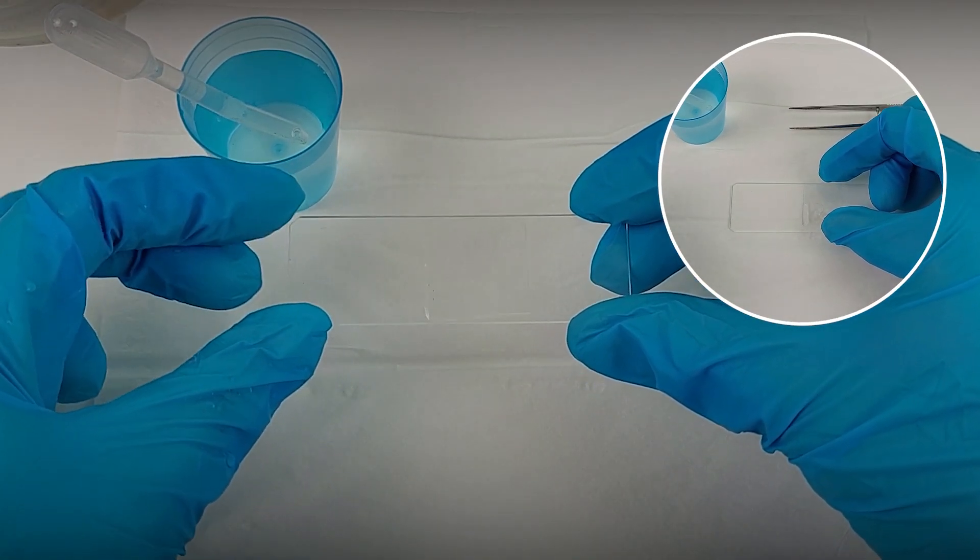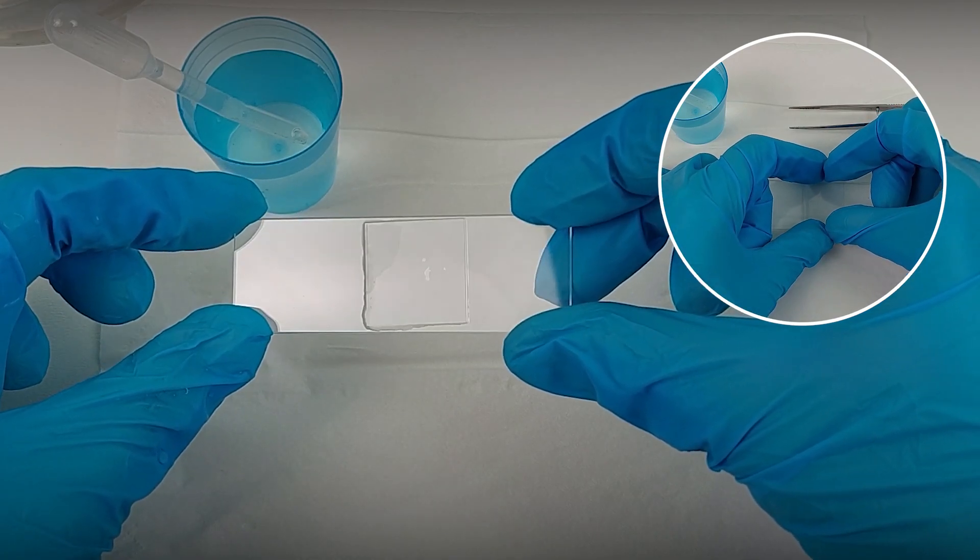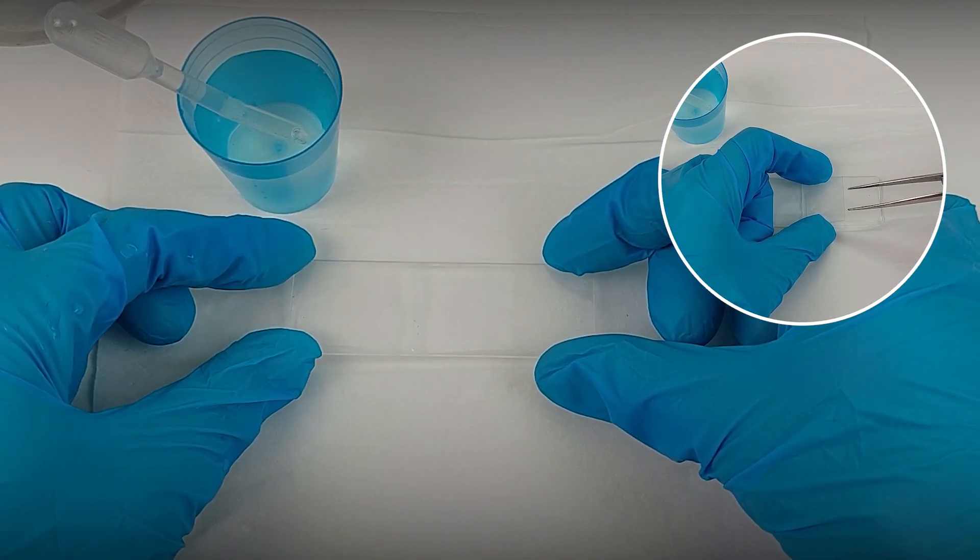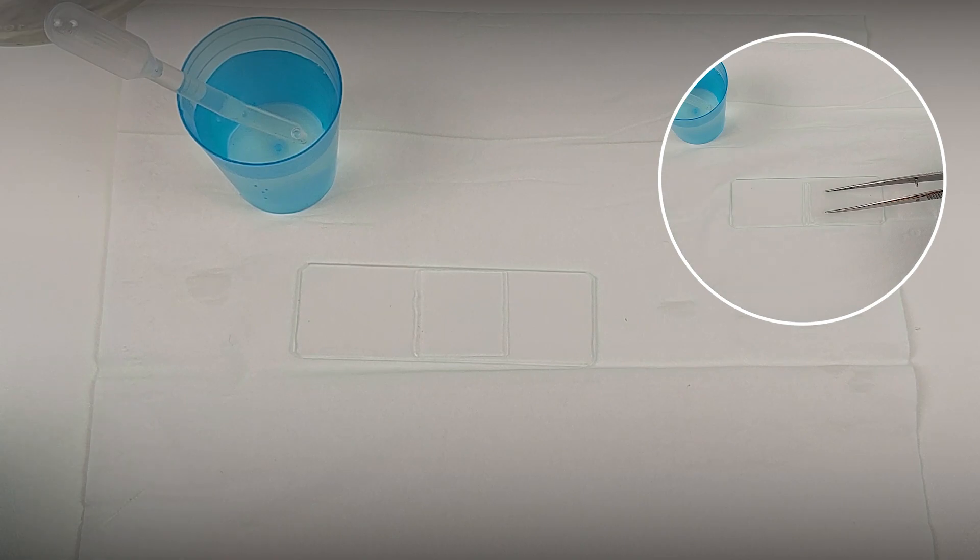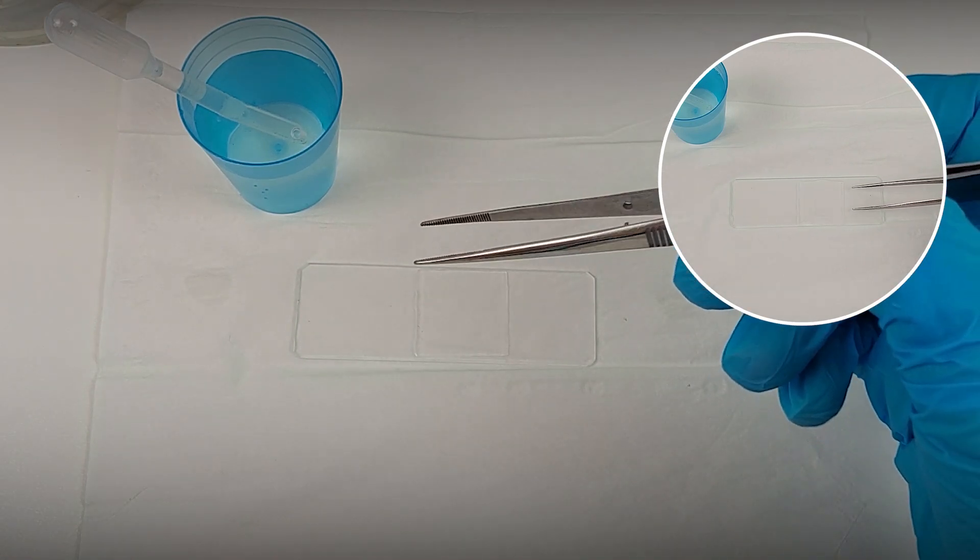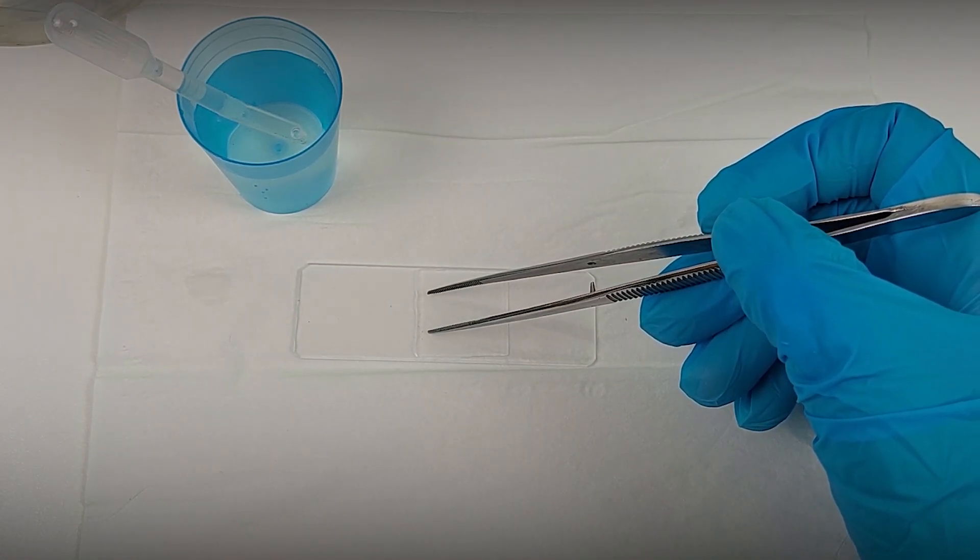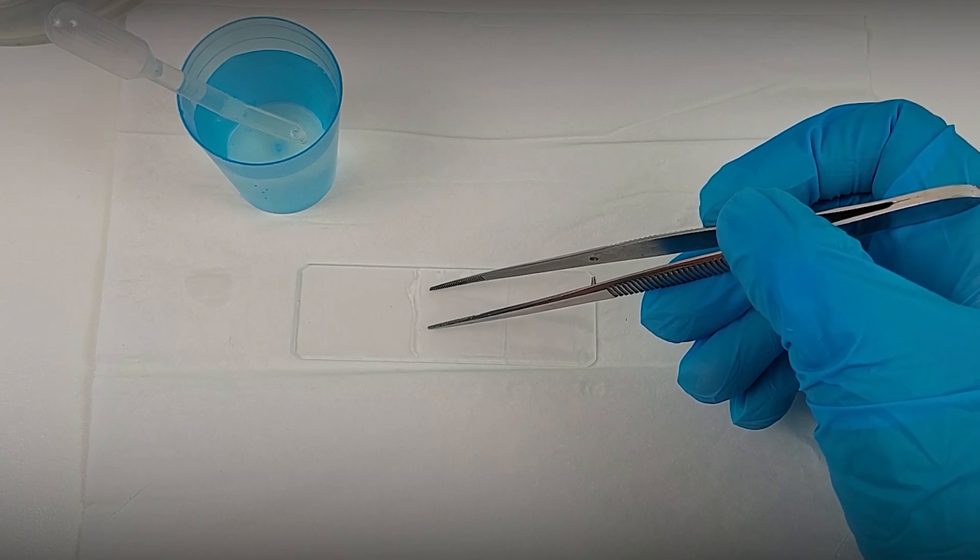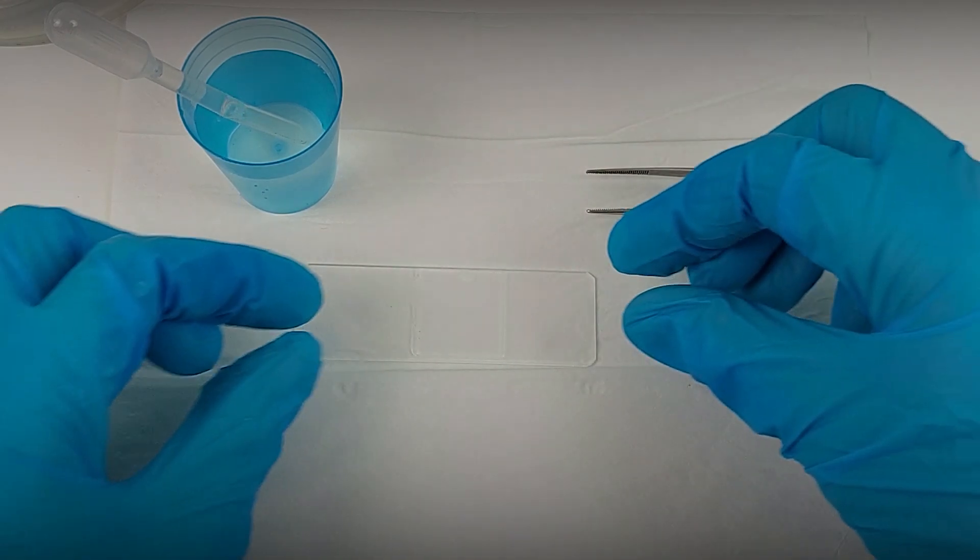If you get many air bubbles, use a needle or tweezers to carefully release the cover glass. Pressing gently with the tweezers, distribute the smear between the cover glass and the slide.